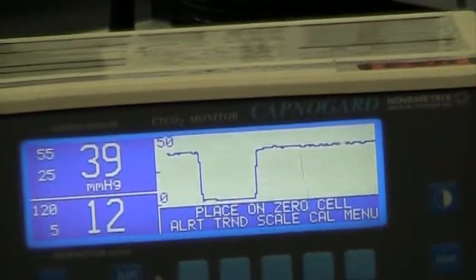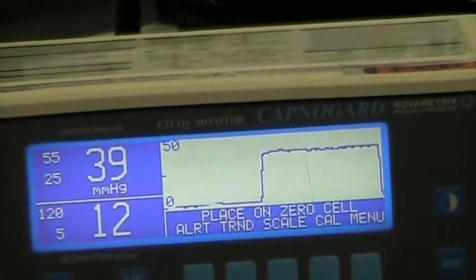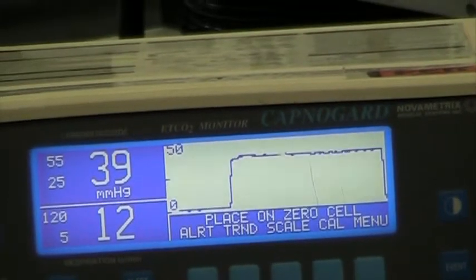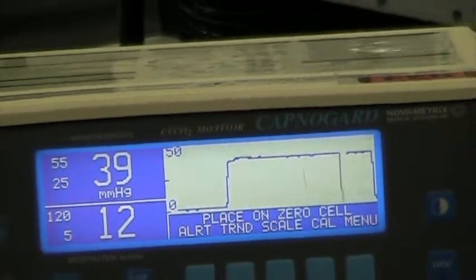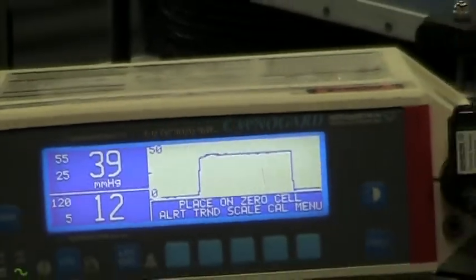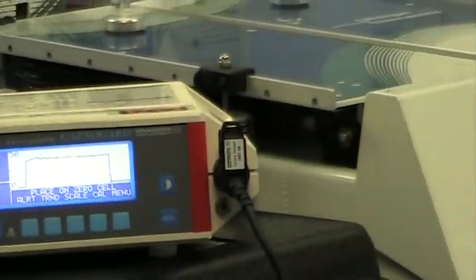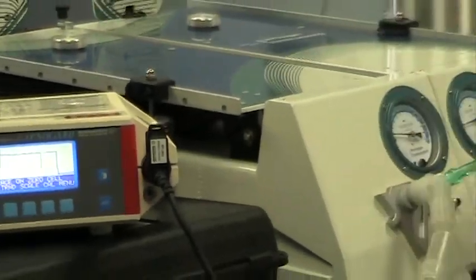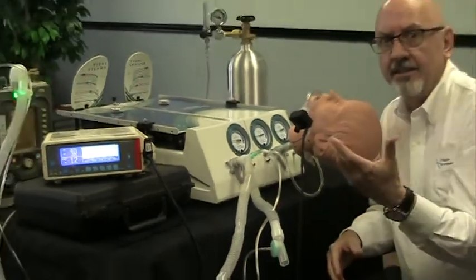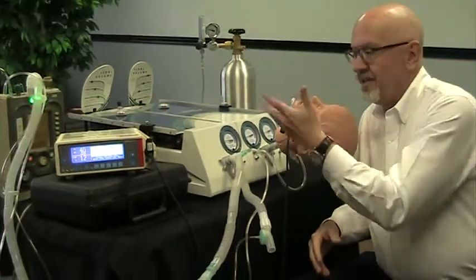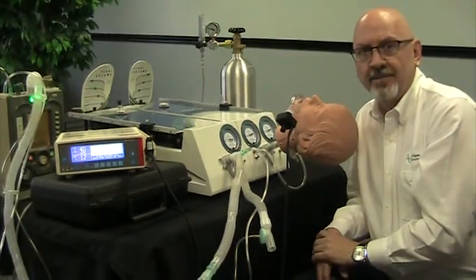This would be ideal for changing ventilation rates, changing tidal volumes, changing the amount of CO2 being produced, and looking at those results. Again, this is a question that comes up quite frequently: can we introduce a gas into the lung and measure it coming back out? This is how you can do that.